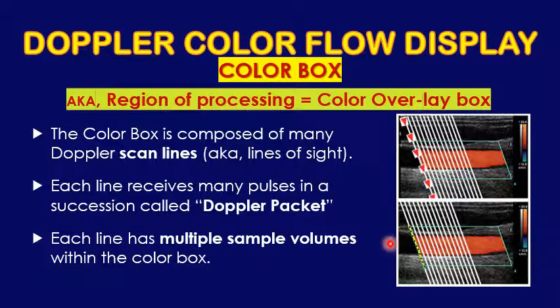On each scan line within the color box, from this depth to this depth, there are multiple sample volumes along each scan line. So again, we have many scan lines. Each is receiving a packet of pulses, and within the color box each scan line is displaying its color along many sample volumes.